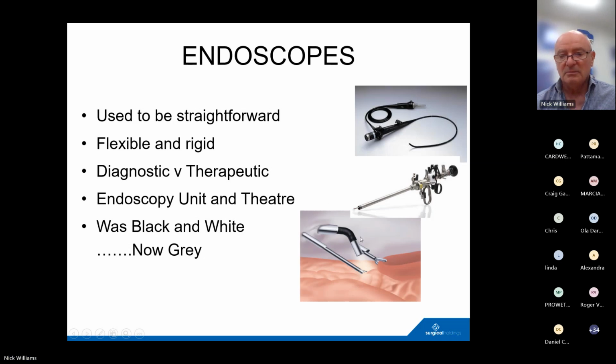You've now got something like this. This is effectively a telescope with a flexible tip for use in laparoscopic surgery. So that can be angled. You could go beyond the area of interest and look back on it, for example.